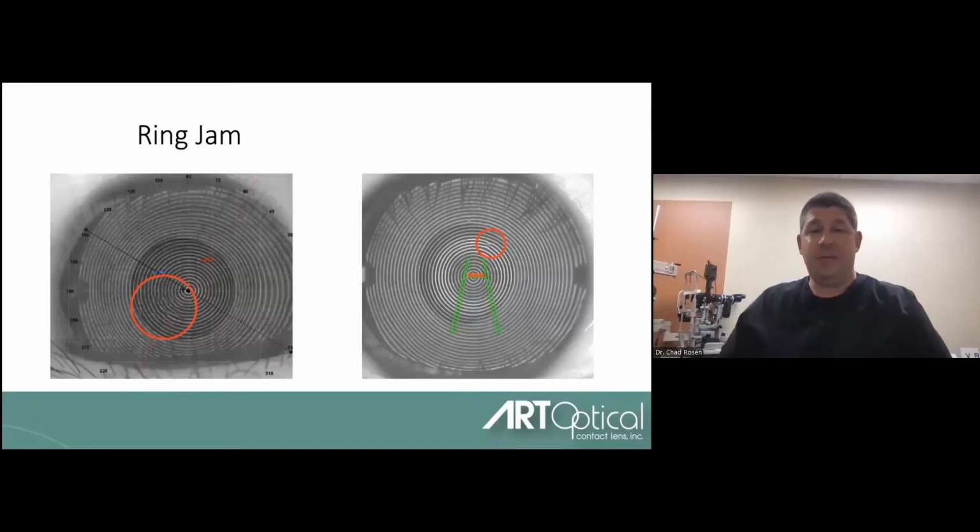In really bad cases, if you're trying to get curvature of a keratoconic just to try to get a starting lens fit, I've seen people put low-powered soft lenses on to mask some of that to get a little bit more of an image. In Ortho-K, we're probably not worrying so much about scar tissue, otherwise we wouldn't be doing an Ortho-K lens. For Ortho-K, it's more about the tear film breaking up or possibly about epithelial tissue being lost. Mainly at day one, we might see a little bit of punctate staining. We might struggle to get a perfectly pristine set of rings on somebody at day 1. But what we're mainly focusing on now is getting a good baseline topography.